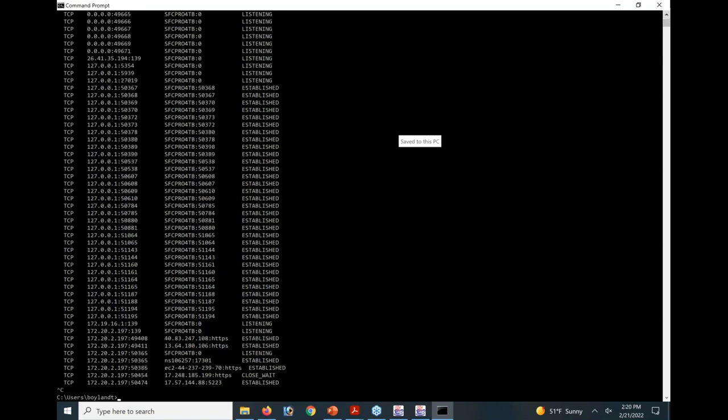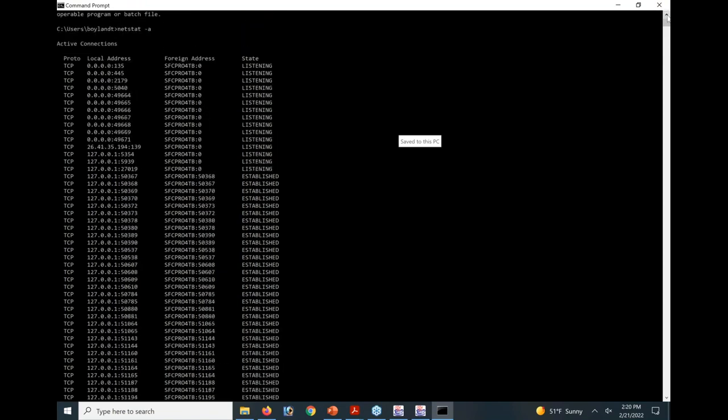It constantly updates? Yeah, it's slow. Notice port 104 is not open. It goes from 135 to 445, it's all numeric. Why is 104 not open? There's no software on my laptop right now running PACS.